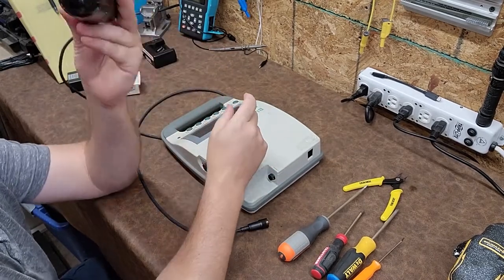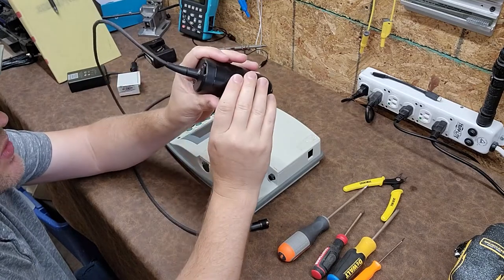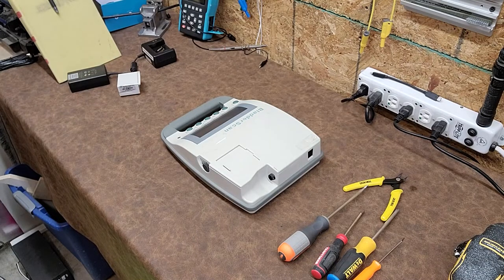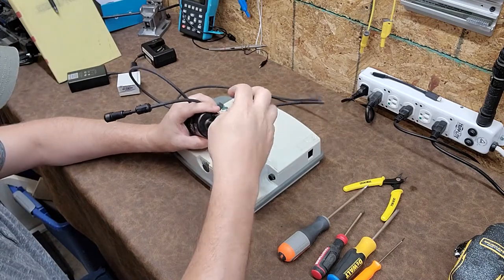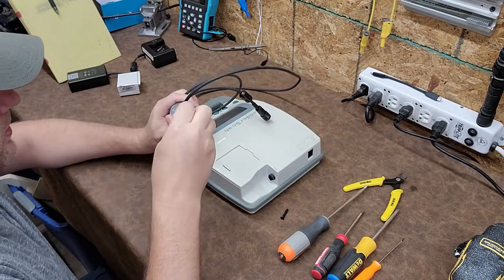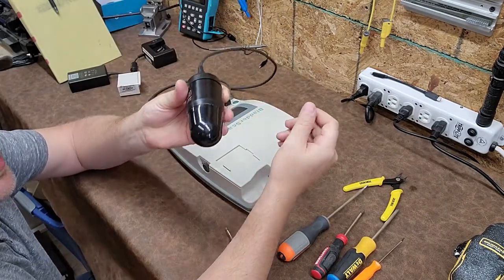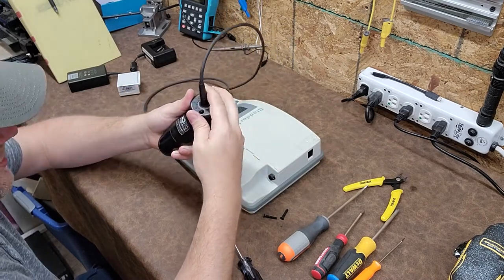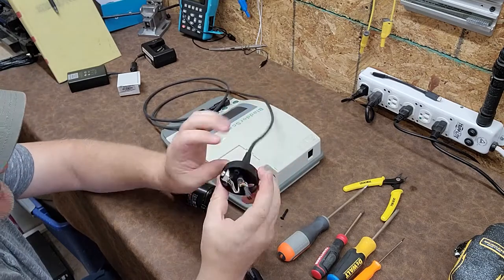The Verathon bladder scanner has a probe — this dingus right here is the probe. It does have a scan button; when you press it, it activates and does its thing. I've never opened one of these, I have no clue what's inside it. Let me get a Torx bit that's going to fit this — looks like a T10. There are two Torx bits on the back of the probe. The number one thing that happens to these bladder scanners is people will drop the probe, and you'll see indent circles in the black plastic. As soon as I see those little circles I already know that something is really not going right.